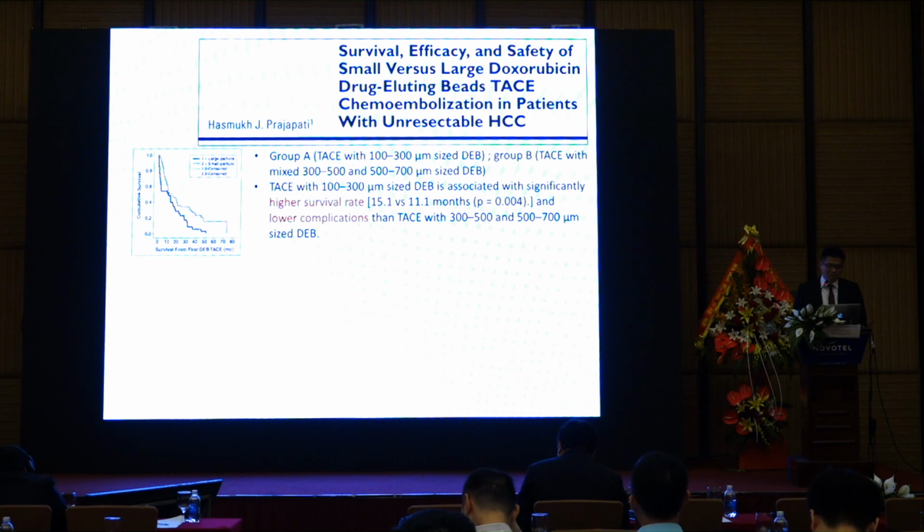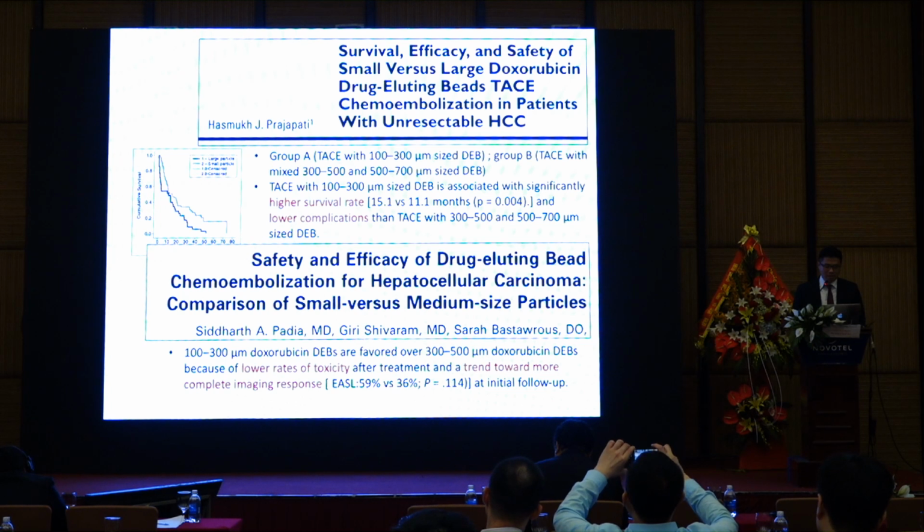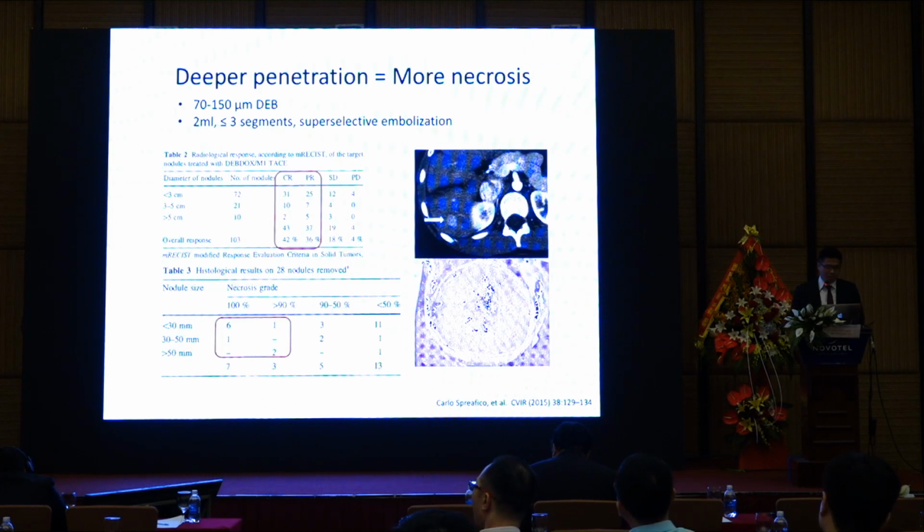In vivo studies show that if we use smaller beads, it can bring a higher survival rate and a lower complication rate. Another study showed a lower rate of toxicity and more imaging response by using beads smaller than 300.